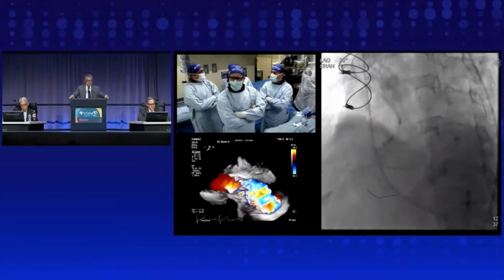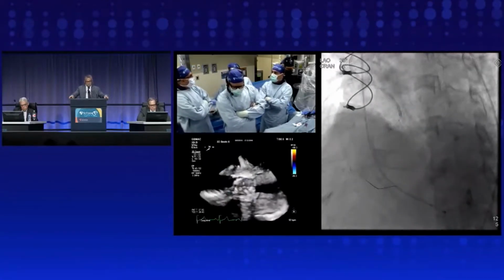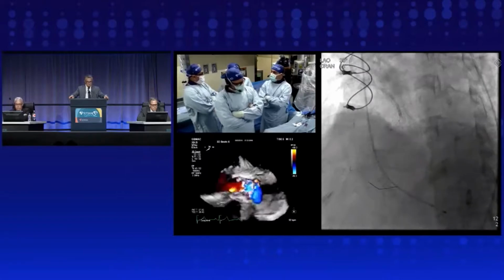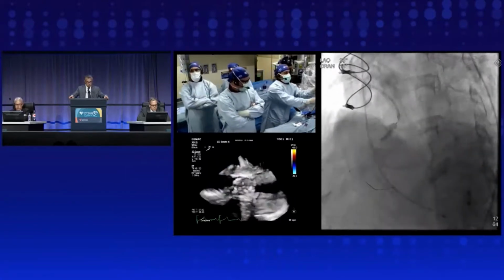Initially developed for renal stenting, it really is an attractive device in the coronary, especially when you want to get that flush apposition of the stent. So at this point, I'll ask Danny to catch us up as to where we are.